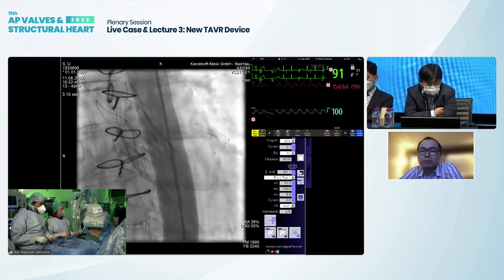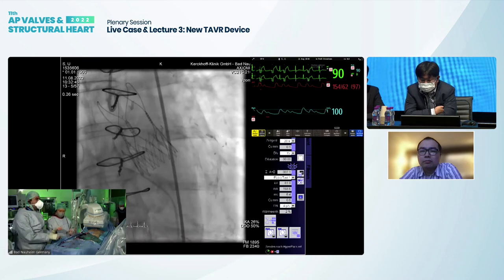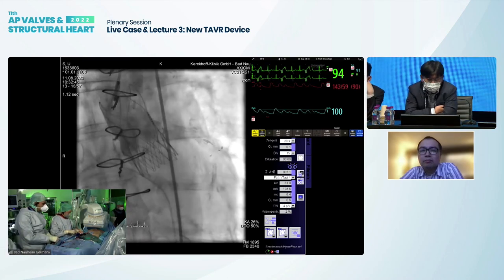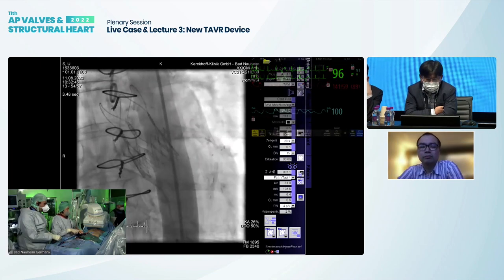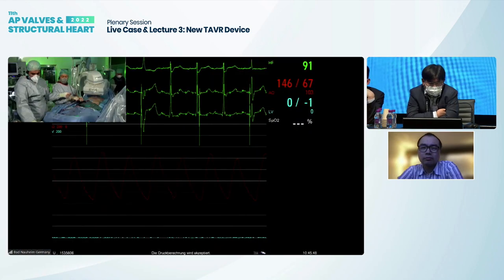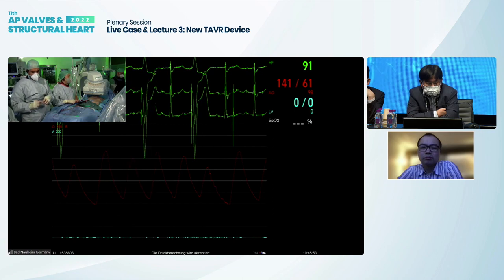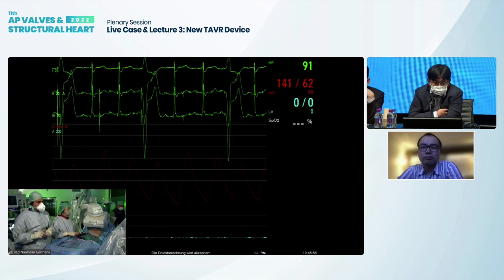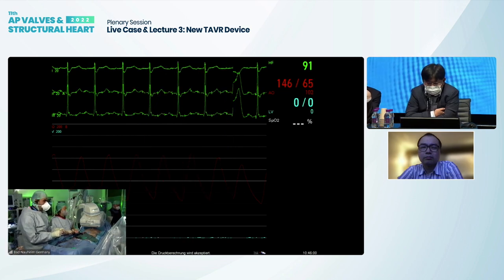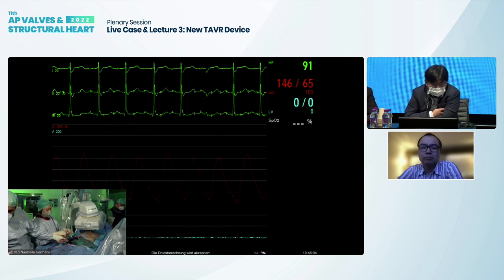Diastolic pressure is about 60, so it's 2+ though. I don't agree with the minimalist approach. Yeah, perfect. So leave it alone, a little bit. It's not perfect, but it is in the acceptable range of PVL, so leave it alone would be a good option. What is the AR index here? The question is, will ballooning seal that or not, or will it not work because it's low? So, Ellen, any comments from your side?